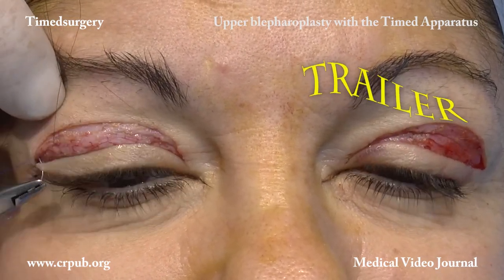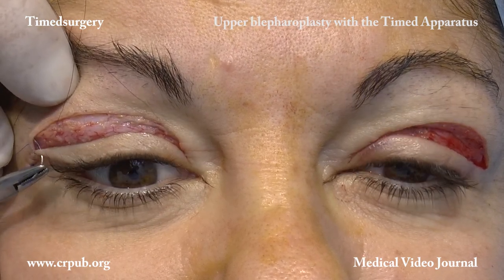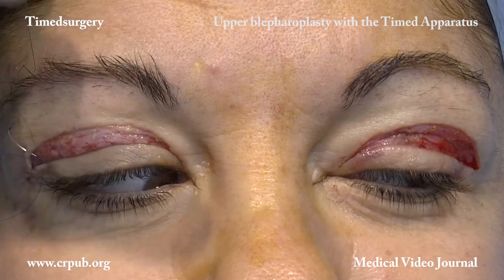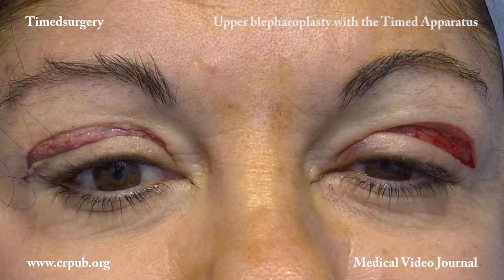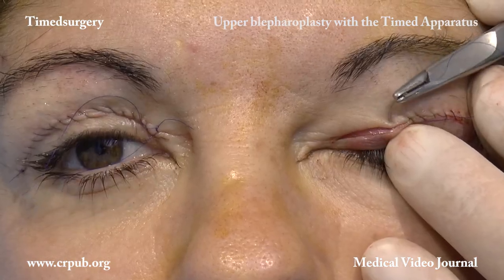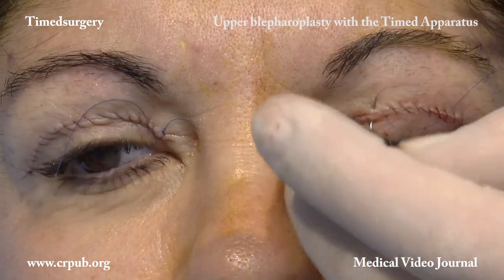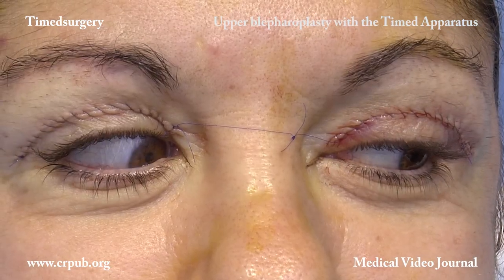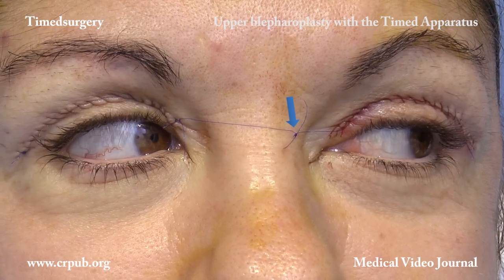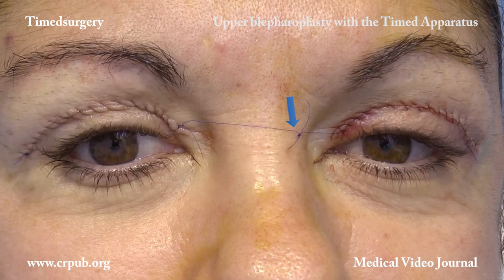Spiral suturing is then carried out with a 6-0 nylon thread. The suture begins from the lateral angle of the excision. The needle passes exclusively through the skin, not through the underlying tissues. The threads of the spiral sutures of the two eyelids are knotted together above the nose. The stitches will be removed after 3–6 days.